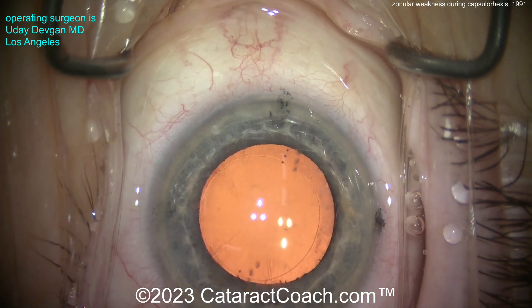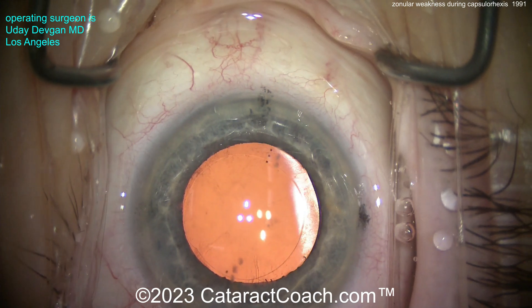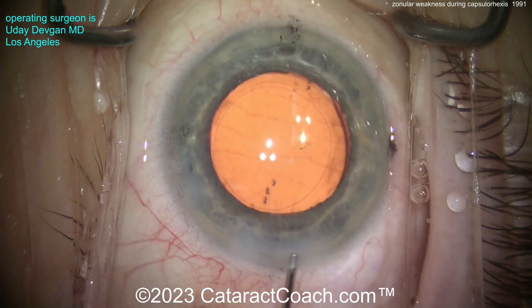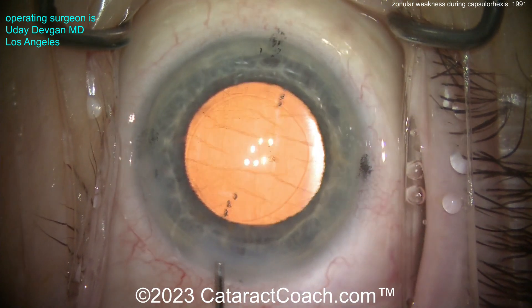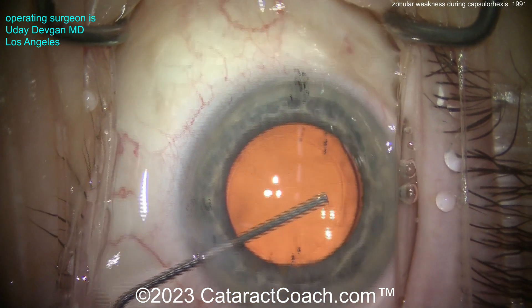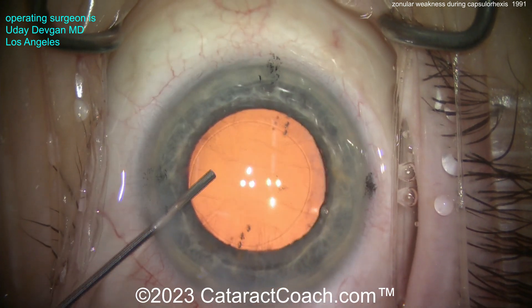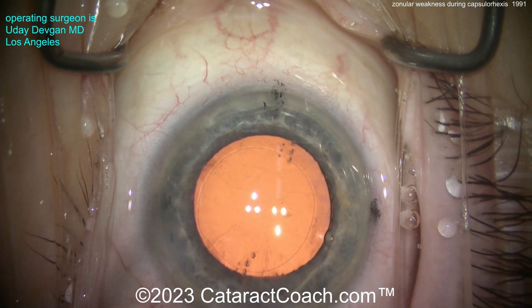You can see this patient's going to have a beautiful outcome. You can see the Purkinje light reflex on the cornea — once that parallax is fixed, the toric marks on the cornea line up beautifully with the toric marks on the lens. This patient had a beautiful outcome the very next day. It's been about a year since the patient's surgery — I dug up an old one for you — and I'm happy to say it's been super stable with no issues. We'll watch the patient once a year.